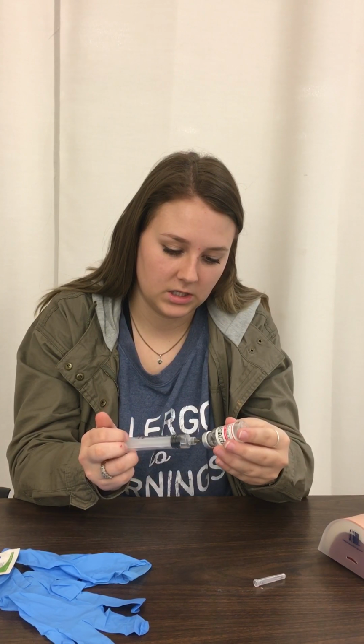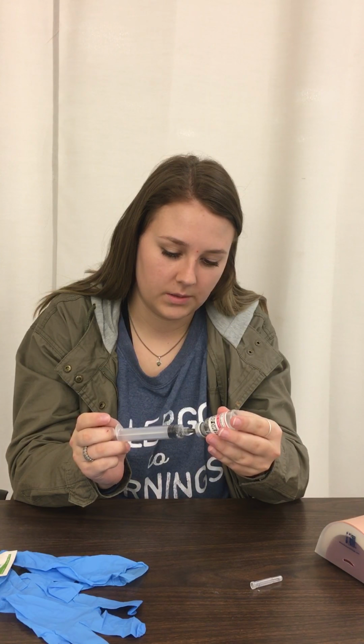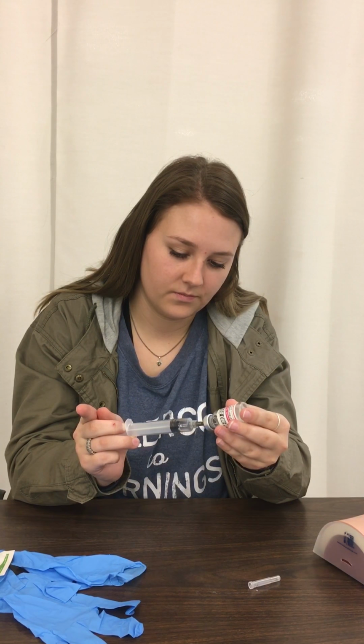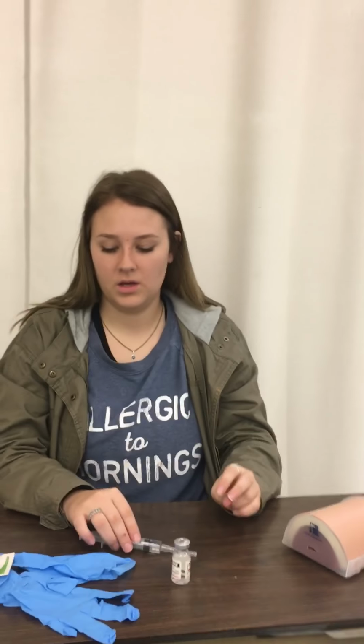3 mLs of the medication, but I got a bunch of air because my vial's pretty empty. Okay. 3 mLs, and then you're going to want to expel any excess air that you have in the syringe. Okay. Alrighty, and then you're going to recap it for safe transport to the patient's room.